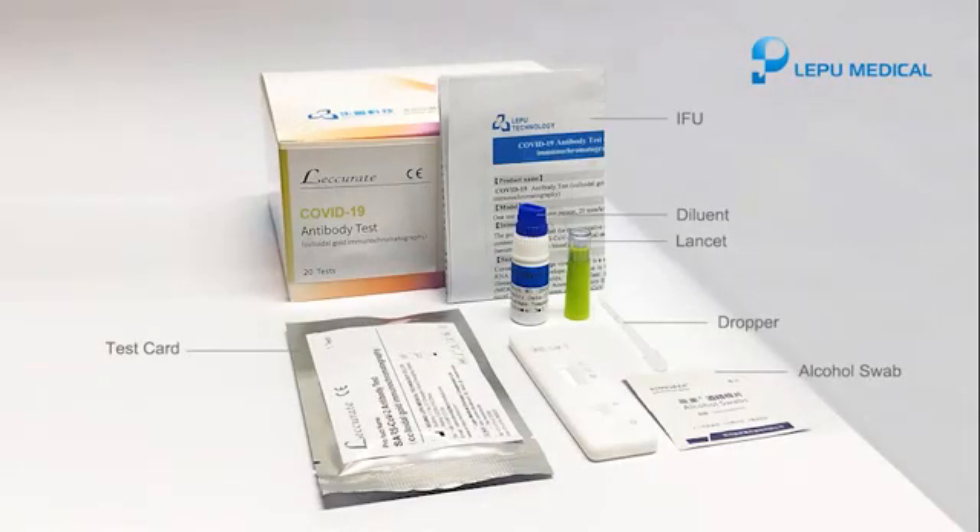Take one test card, one dropper, and a bottle of diluent from the box. Prepare one alcohol swab and one lancet.